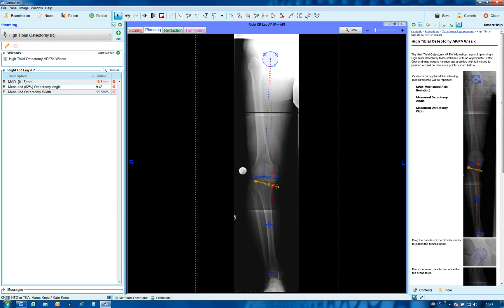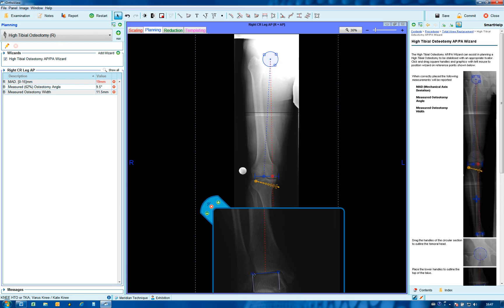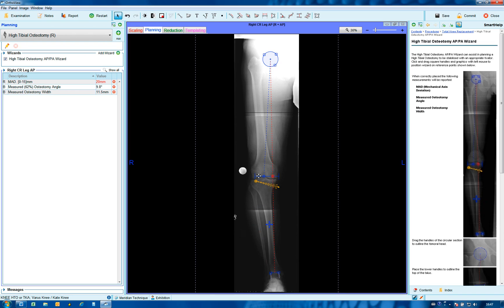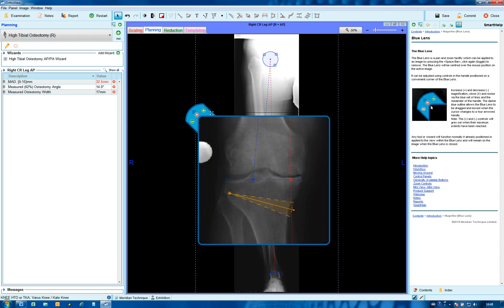For the lower part of the leg, move to the ankle joint and position the handles on the joint line. Roughly position on the tibia and then adjust to either side of the tibial plateau.